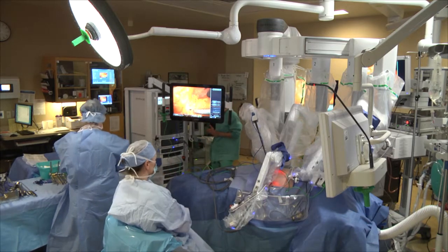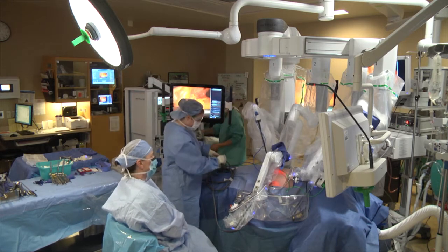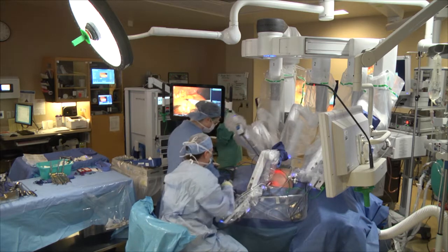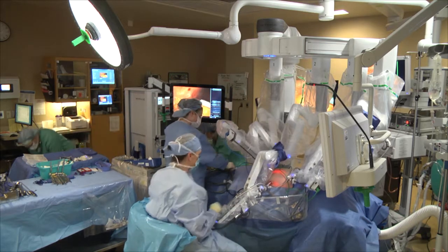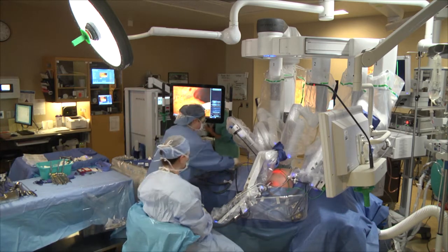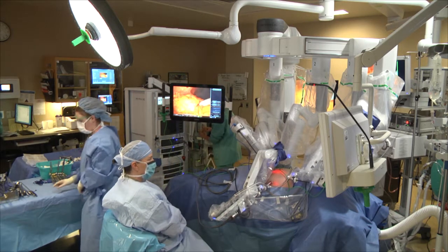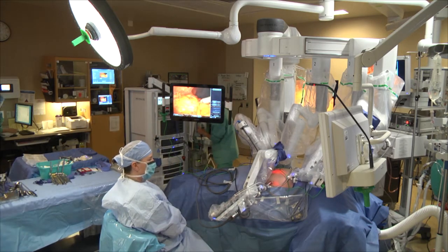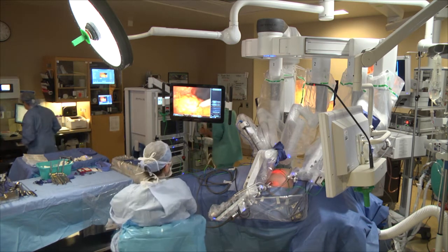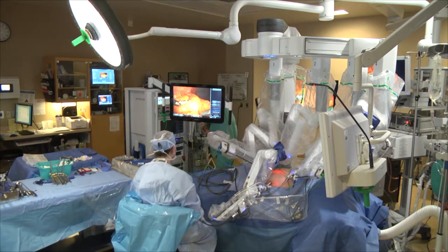So it looks like the vascular images there. I just wanted to point out on the vascular images from the scan that it looks like he has an early branching right renal artery. So the implications for that, as you can see there, it's branching just to the left side of the vena cava. If we try to clamp on the right side of the cava, as we usually do, we're going to have probably three or four different branches by then. So we may end up having to go interaortocaval to get control of the artery and just be able to place one clamp on it.